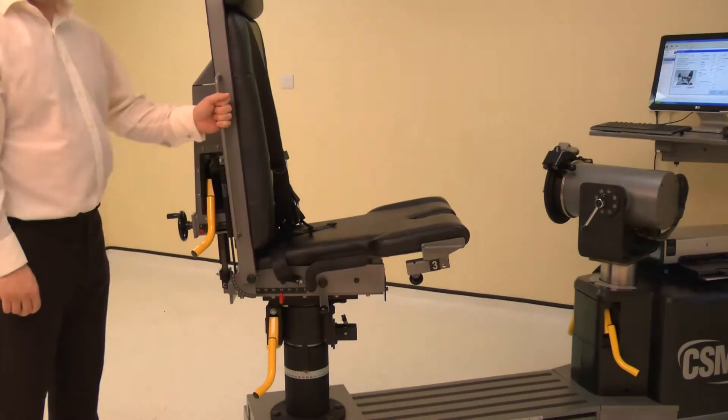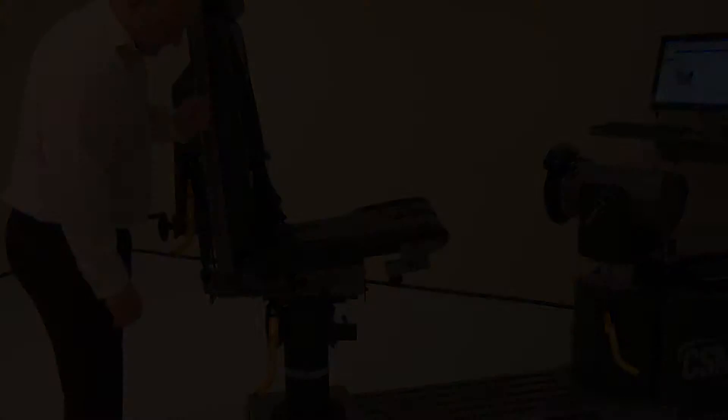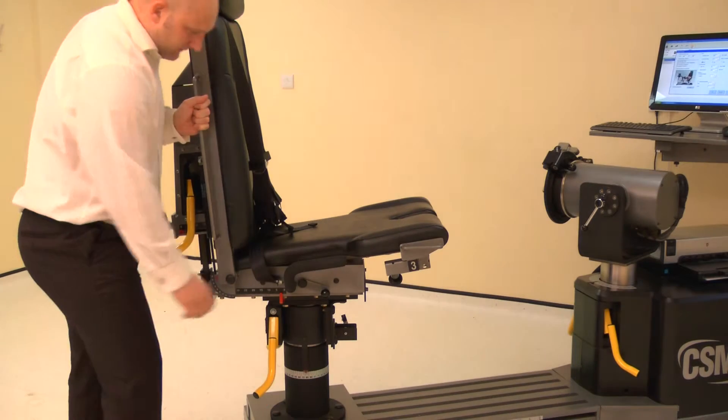The chair fore-aft is altered by raising either locking handle, then slide the chair bottom forwards or backwards. Adjust the chair fore-aft to position 15. Lower the locking handle to secure.